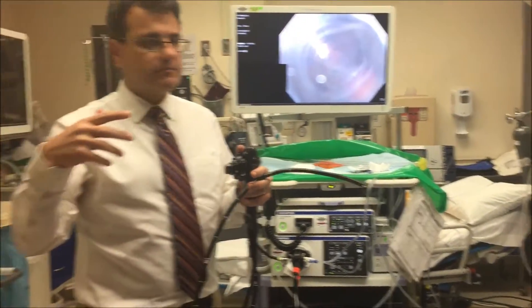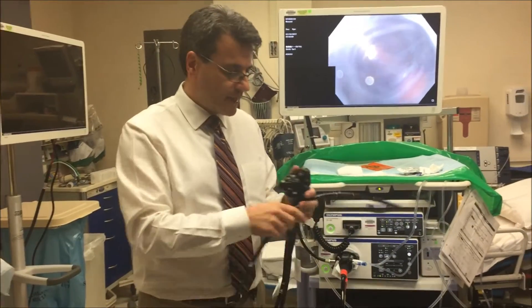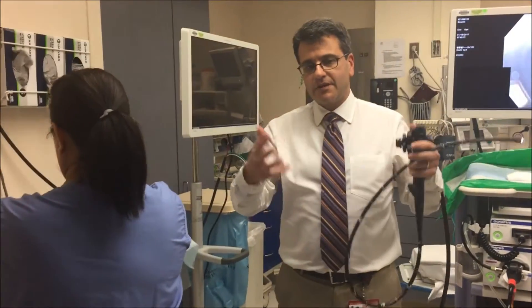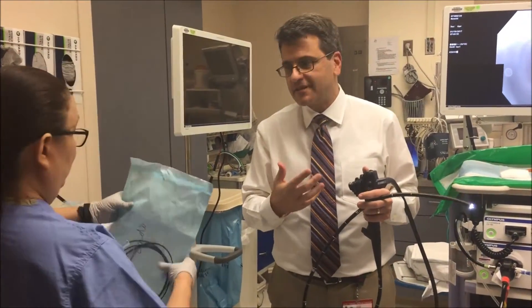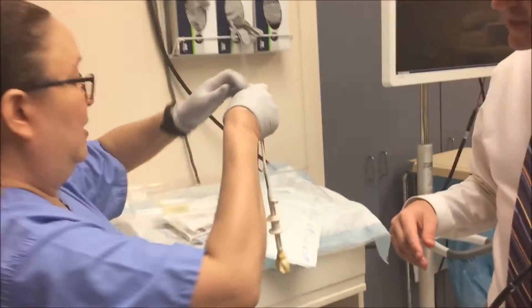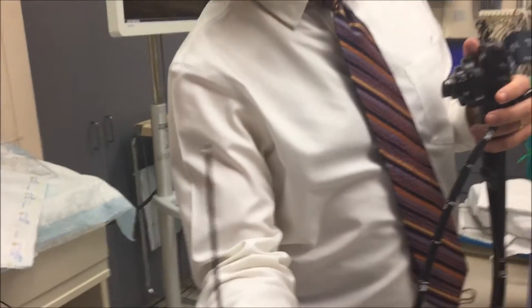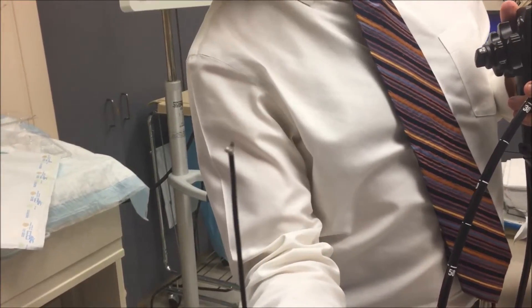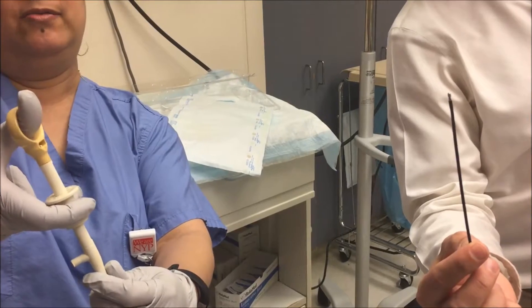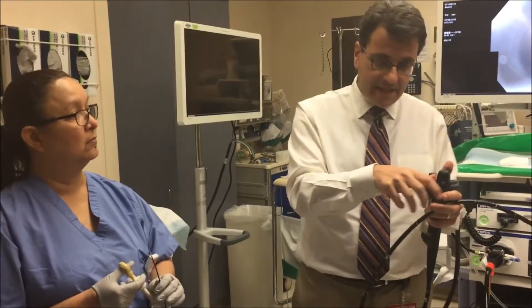Now we're going to go to the equipment that we use to take out the foreign body. Now what we do is we have some tools that can grab — let's call it a steak impaction, a piece of steak caught in the esophagus. This is a grabber. Basically it's just something you open and close — you push it up and down. And now we want to use tools to put through the scope to grab whatever foreign body is there and try to pull it out.